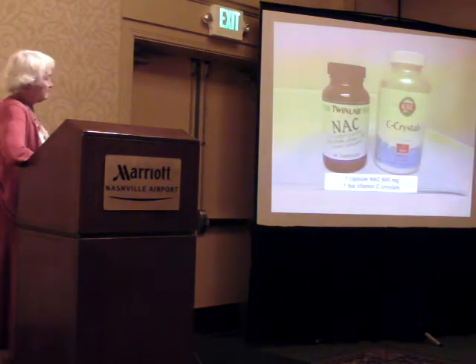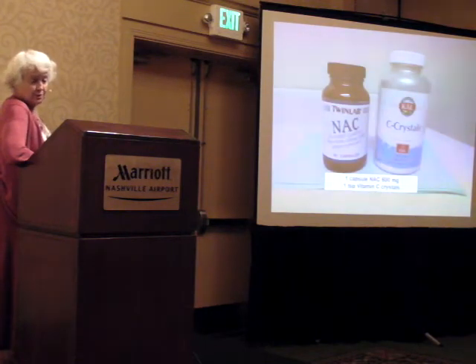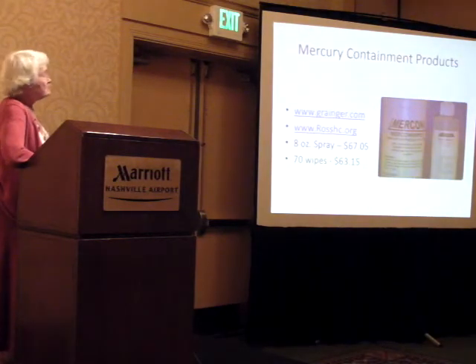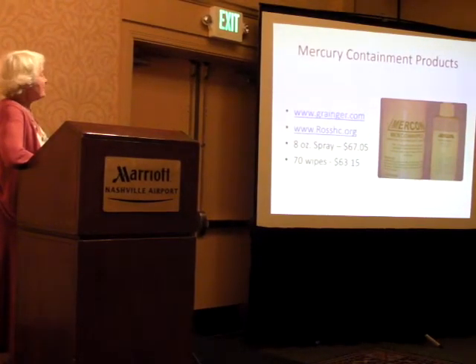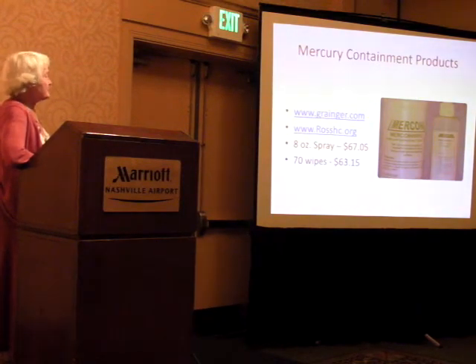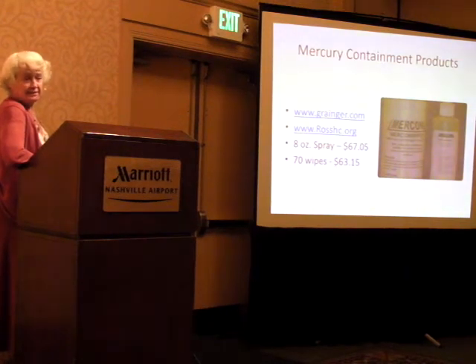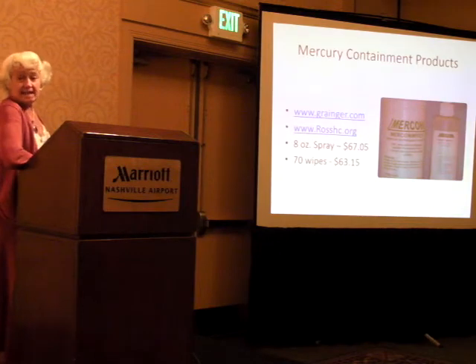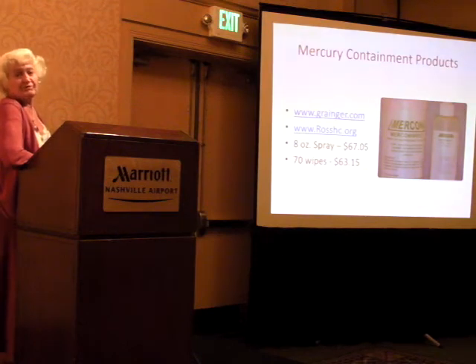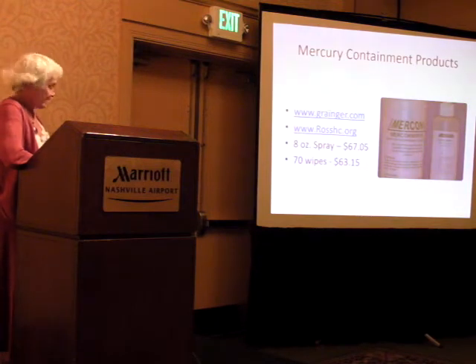There's the combination that I use for the post-op rinse. And this is the mercury containment product that we spray with. It is horrible, the smell of it. It's just like having pure sulfur, but it does a great job. And we like to get the instruments decontaminated and wiped off before they're ever placed in the ultrasonic. Anything that releases heat, such as your ultrasonic or your autoclave, is going to release mercury vapor right into your sterilization area. Sorry, but that's the way it is.